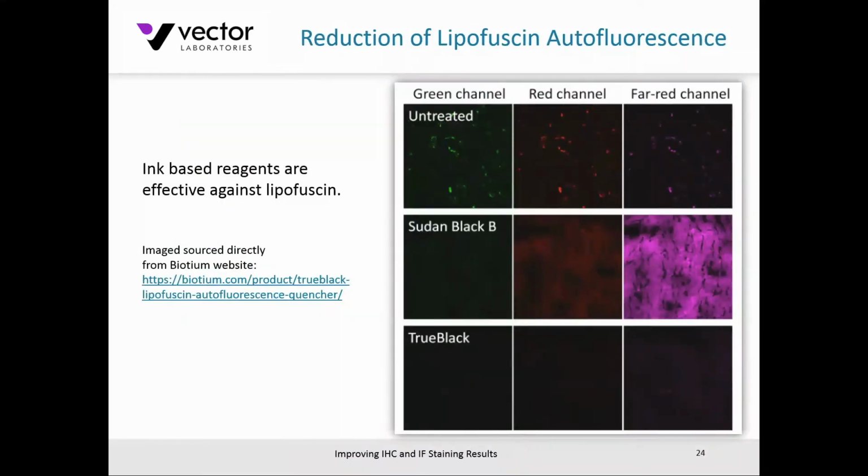Certainly, I would recommend looking at some of the ink-based reagents that are available out there. And I will say that I did take this image directly from the Biotium website. They showcased that the ink-based reagents, something like Sudan Black, for example, is pretty good in the green and the red channel for reducing this sort of punctate lipofuscin staining, but it does tend to increase fluorescence in that far red area. But they do have a product that seems to be effective across the channels.